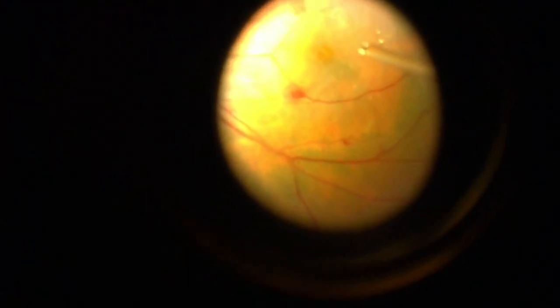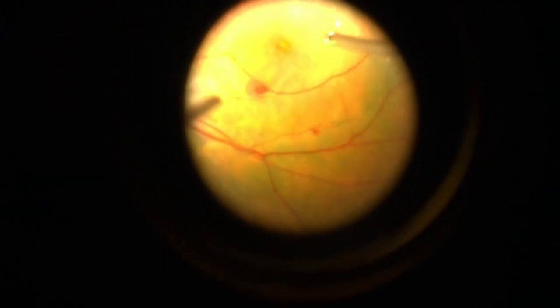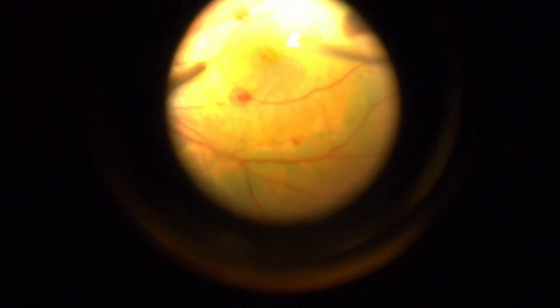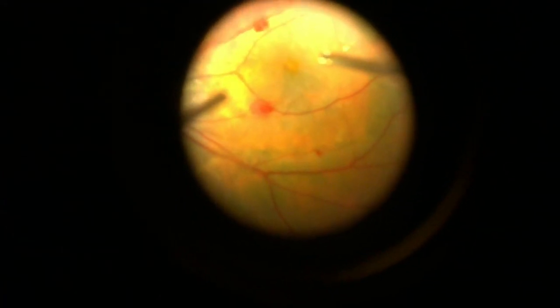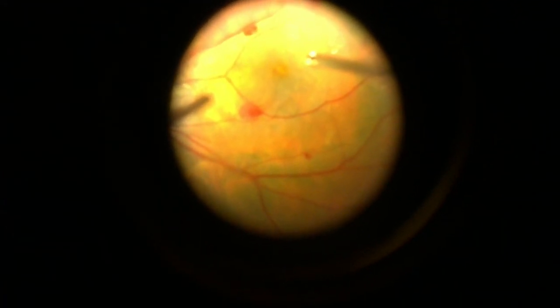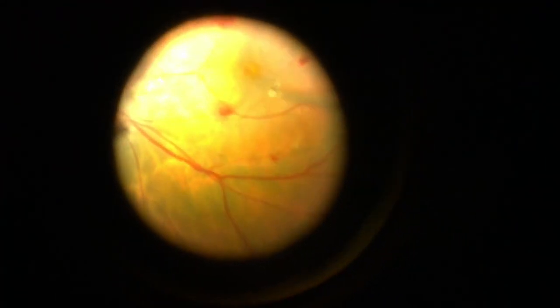And that's about it. So let's take a look at our macula here. We have a big peel of this ERM that was causing vitreomacular traction in a diabetic case, getting lots of Eylea injections. You can see the pseudo hole. When I peeled over the pseudo hole, in fact, you saw the hole kind of jump up and almost look like a volcano a little bit, close to being a full macular hole, but not quite.